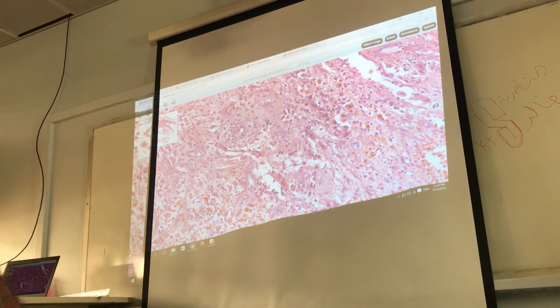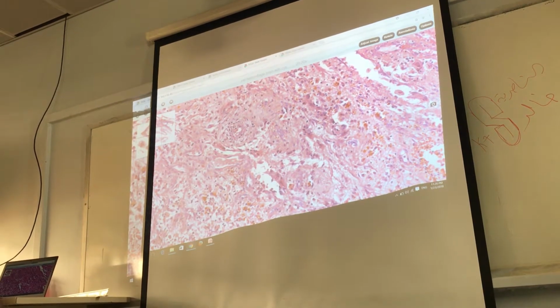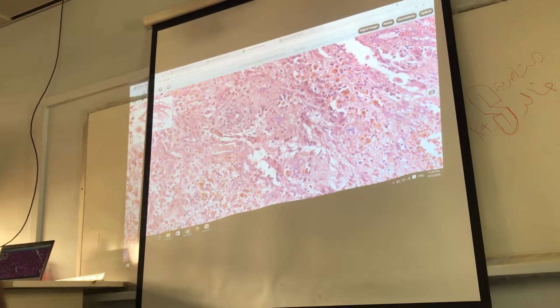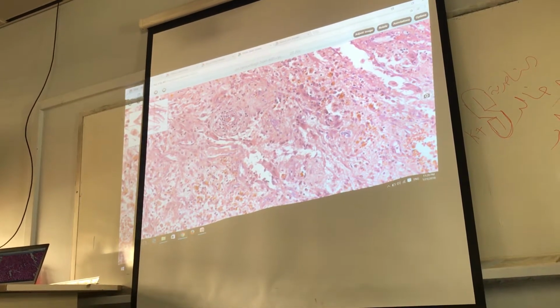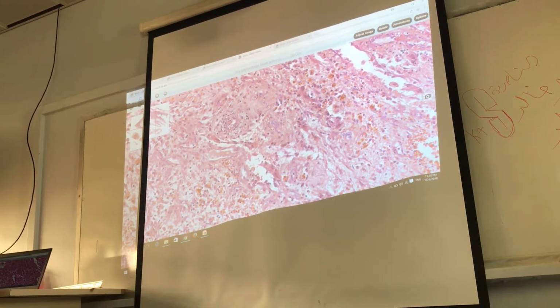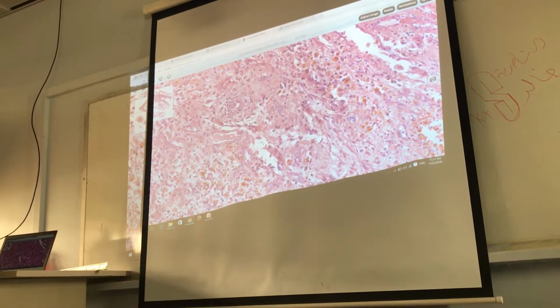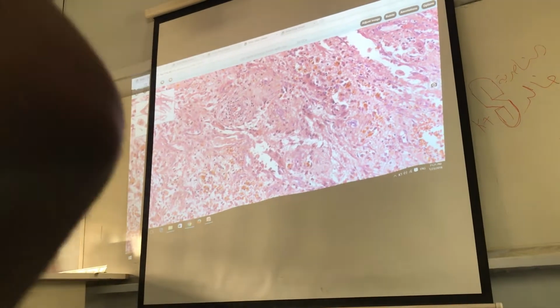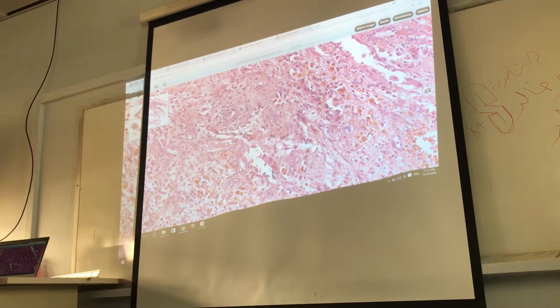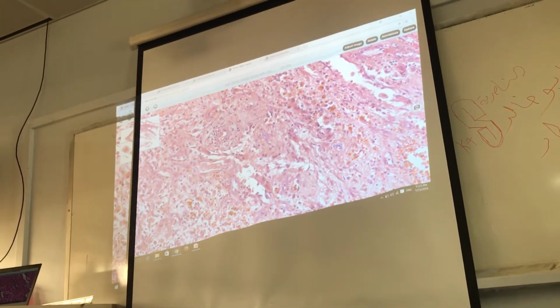Clear? Identify this. Cystic infarct, with hemorrhages. This one, old hemorrhage. You have fresh hemorrhage, recent hemorrhage, and old hemorrhage. How are you recognizing old hemorrhage? Presence of hemosiderin in the macrophage. That's how we recognize it as old hemorrhage. Any more questions? Thank you.